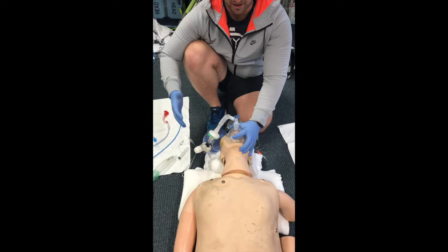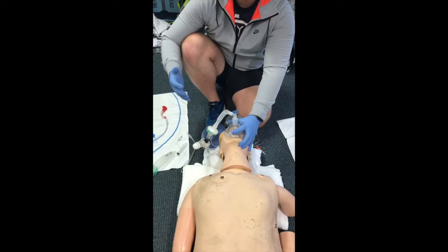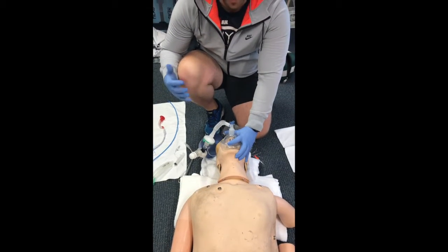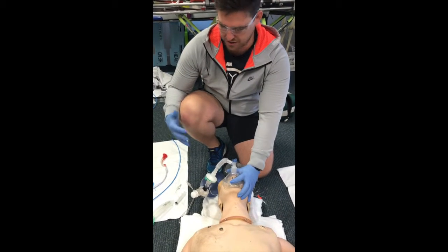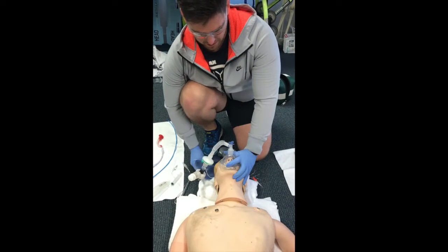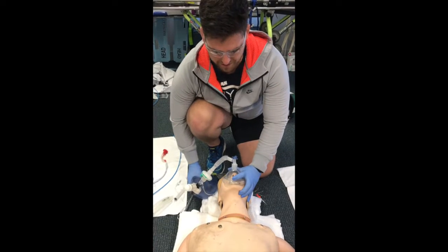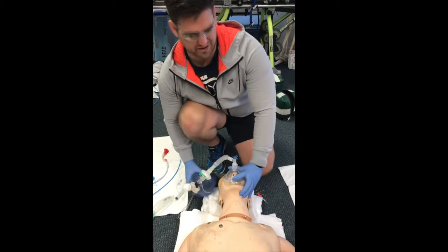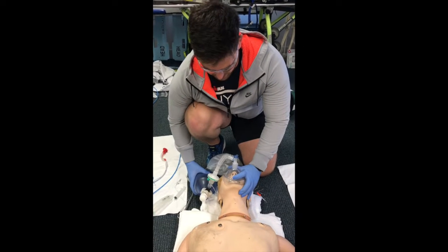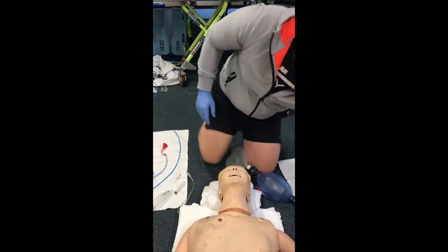Okay, so I'm unable to ventilate, I'm unable to oxygenate, so I'm in a can't intubate, can't oxygenate scenario here. So the biggest thing here is the decision to cric this patient and not deliberate on this any longer. So we're at that decision now. Ideally, in this situation, I would have an assistant here attempting to bag valve mask the patient at the same time that I'm preparing to do a cricothyroidotomy.